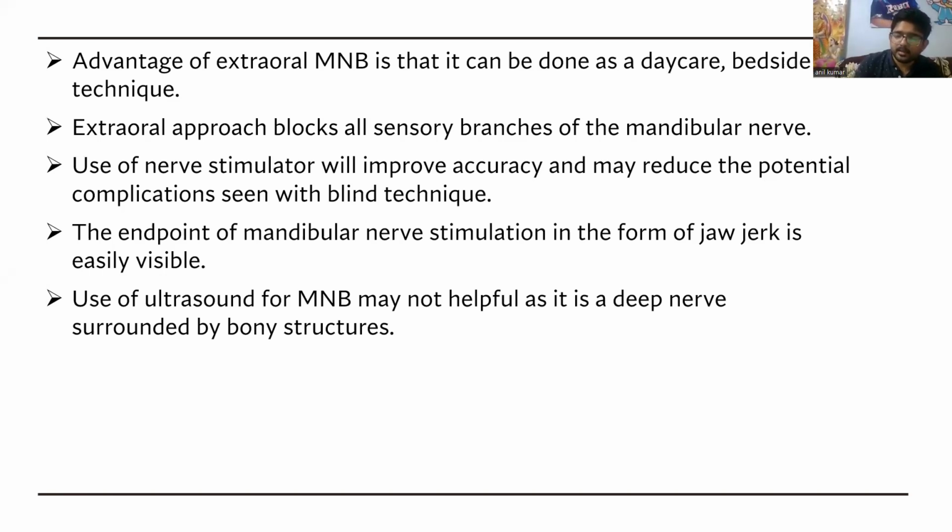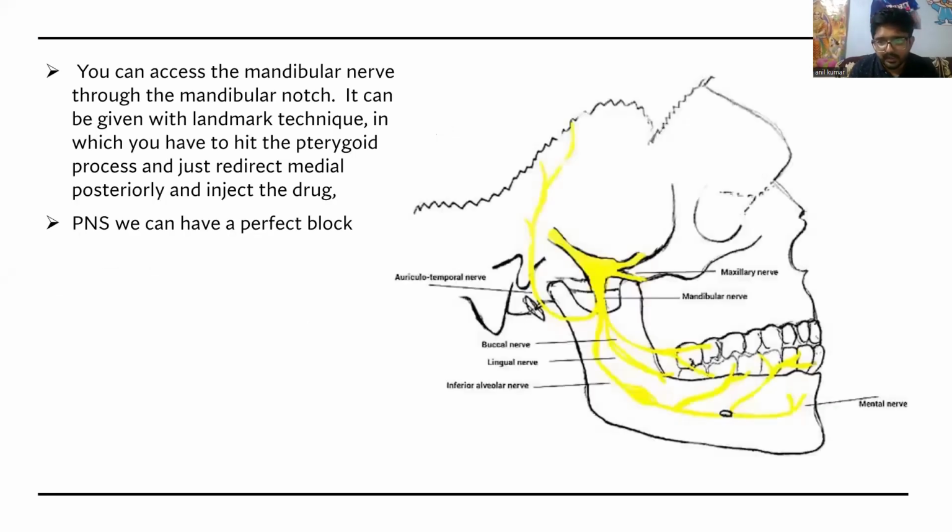So high skill is necessary for performing the mandibular nerve block under USG guide. But performing the mandibular nerve block PNS guided is a very easy technique, and you can very accurately block the mandibular nerve. So here it is, the mandibular nerve.